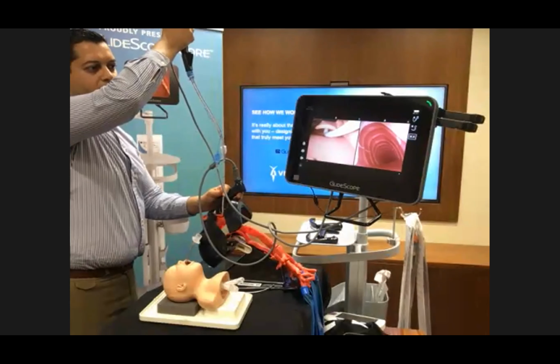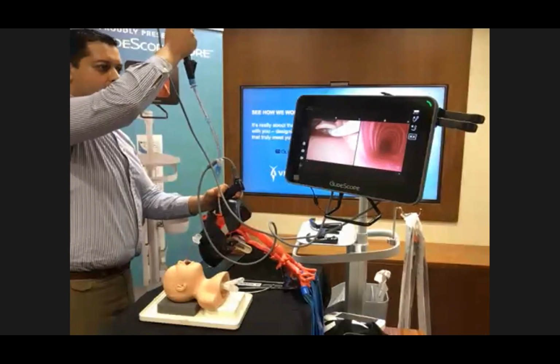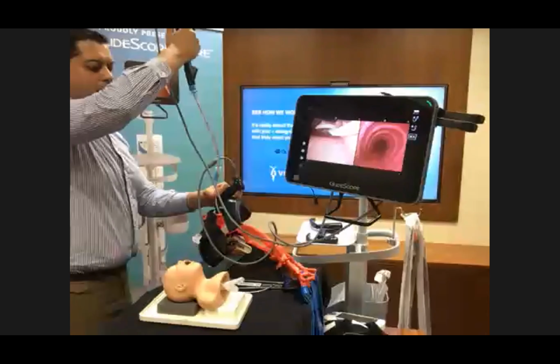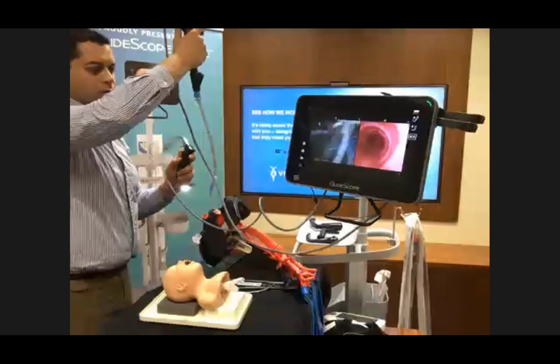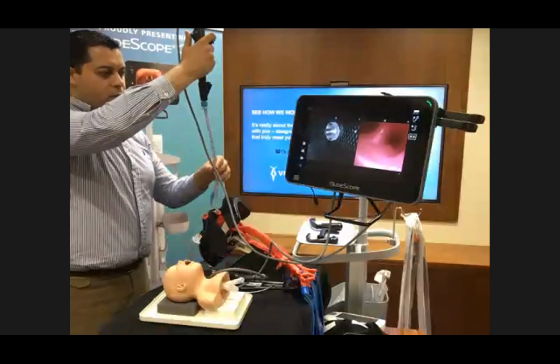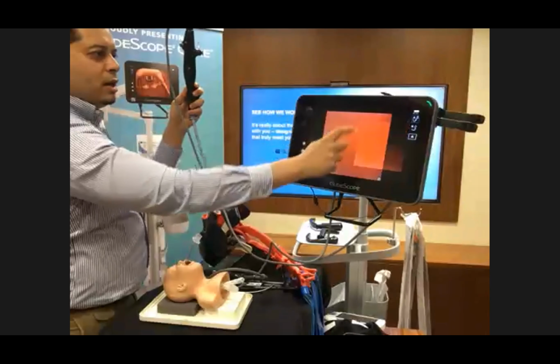So the tracheal ring here, you might be able to drop it further and see inside. So you're already inside, once the video laryngoscope blade has done its job. Once you're inside, if you don't want this, you have the MagnaView.